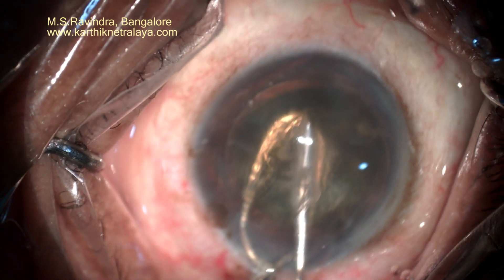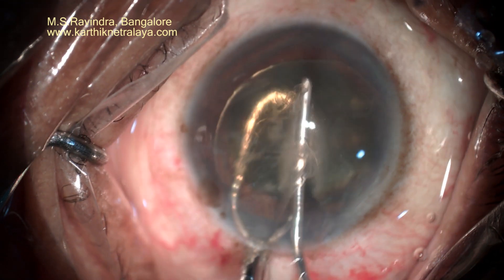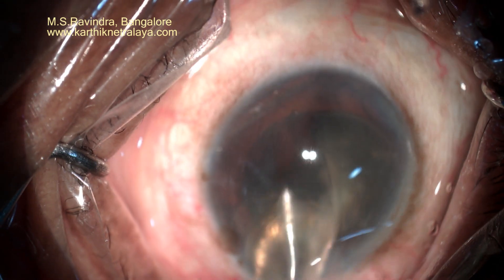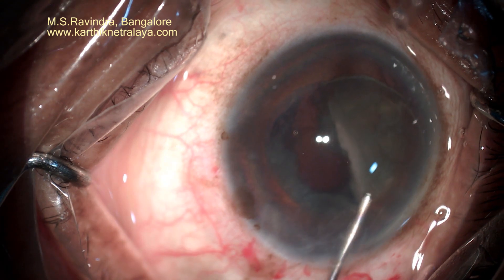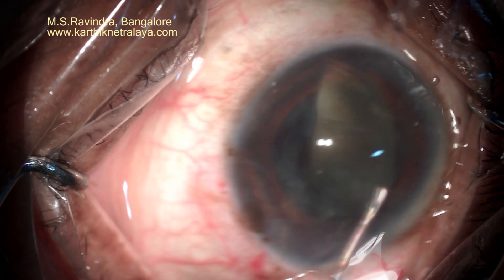It is a 25-gauge cannula that I am going to use to bisect the nucleus into two in the anterior chamber, while the cannula is continuously infusing dispersive visco. This protects the endothelium as the nucleus is moved in the anterior chamber. I am continuously injecting visco even now.